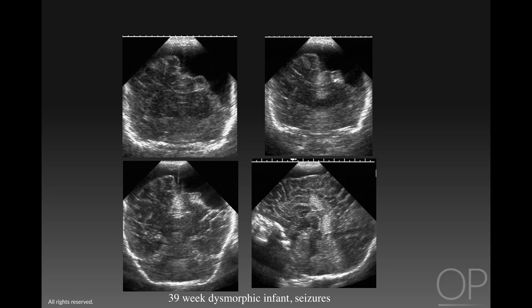Another type of focal echogenic lesion is commonly seen in patients who have other anomalies of the brain. Here we see a 39-week infant who is dysmorphic and has seizures. On the sagittal midline image, there is only a partially formed corpus callosum and brightly echogenic lesions in the midline posterior to the genu of the corpus callosum. In this situation, these brightly echogenic lesions represent callosal lipomas.